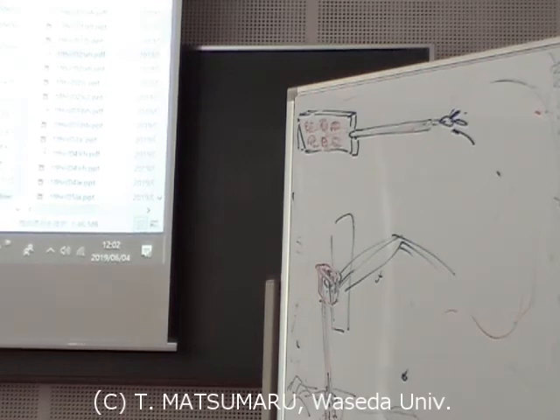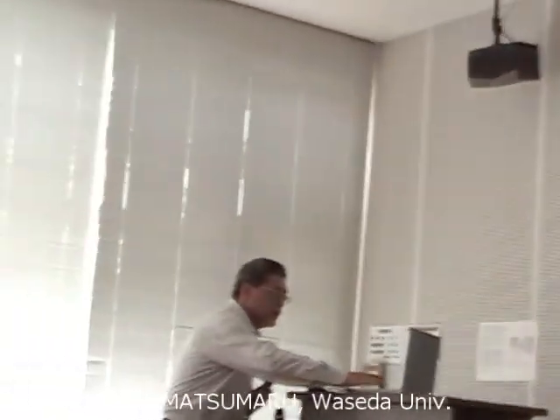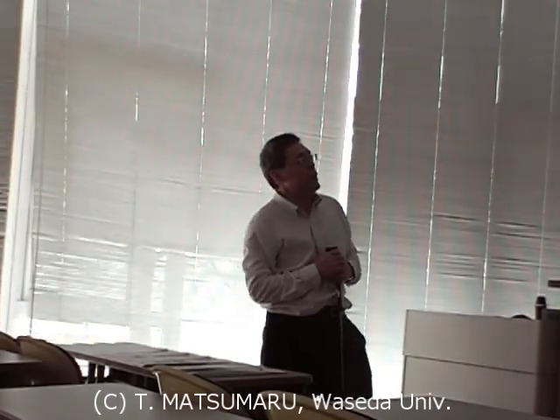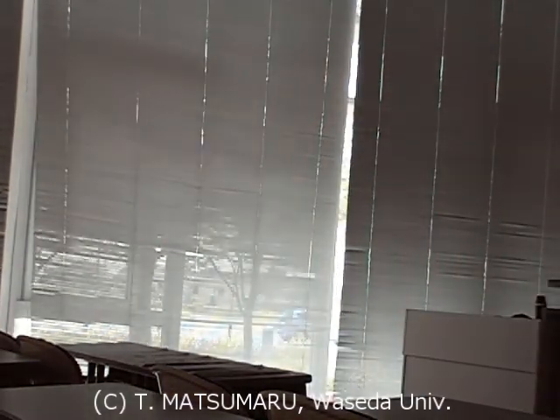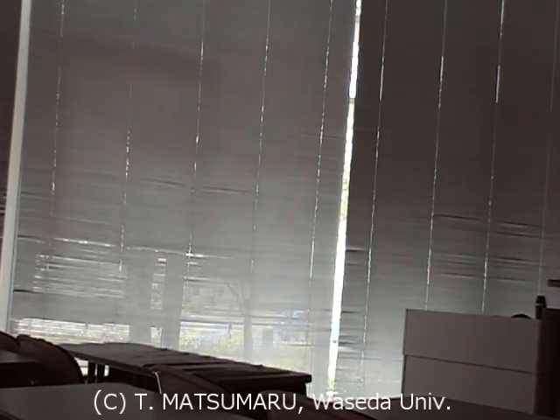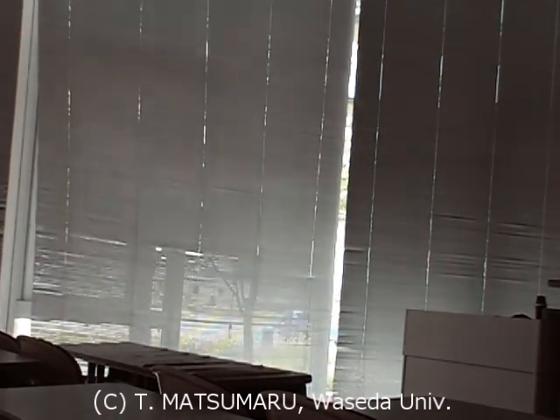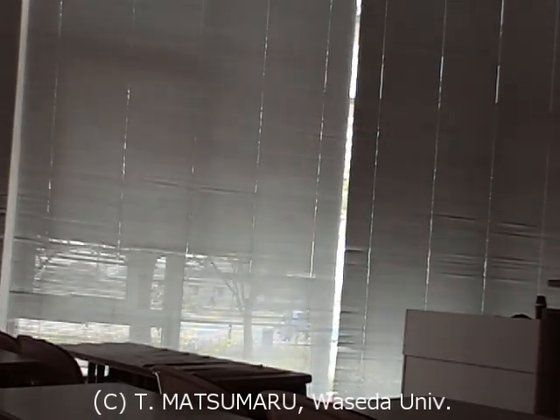The assistive technology, computer control, filters out things like the naturally occurring hand tremor. So the surgeon's tremor is filtered by the robot control for him. So it is good. The software technology is reducing the vibrations. And the physician does not need to be in the room, or even at the same location as the patient, which eliminates intraoperative infection. It also provides a better work environment for the physicians by reducing strain, stress and fatigue.